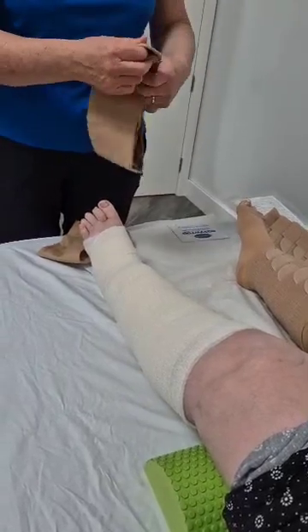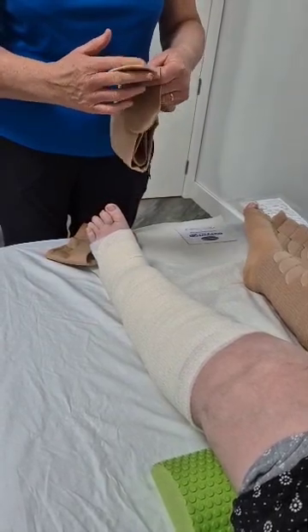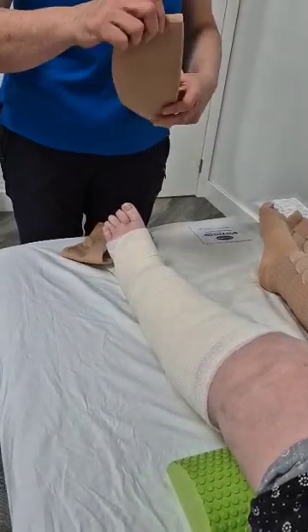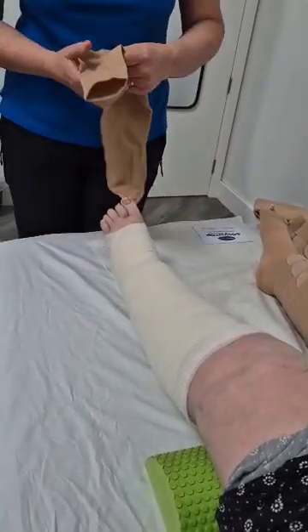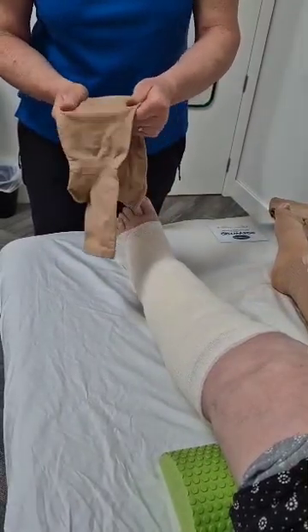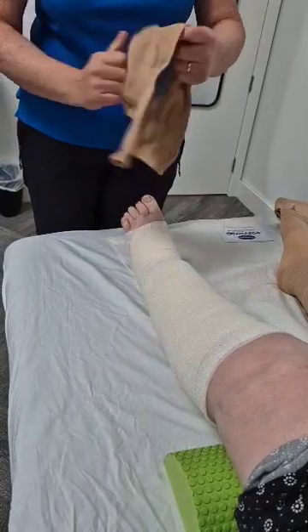These have a closed toe, but you can cut them without problems, and you can make them so that they're open toe. It really depends, but anyway, that is not something we're going to worry about just at the moment. Okay, so these garments have compression in the foot, but they don't have compression in the leg, and these are liners, and they go underneath the Easy Wrap.